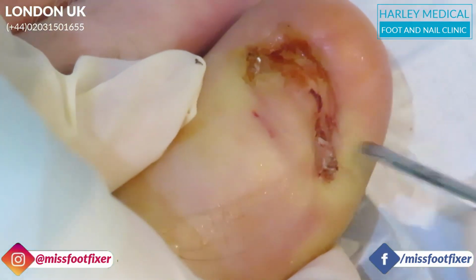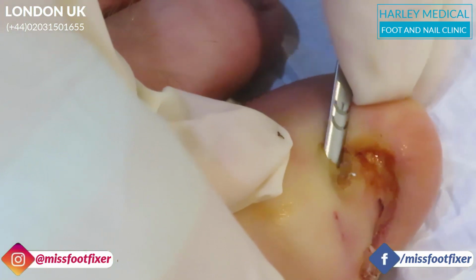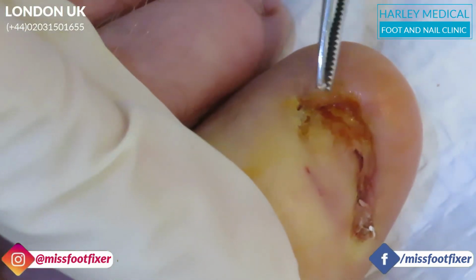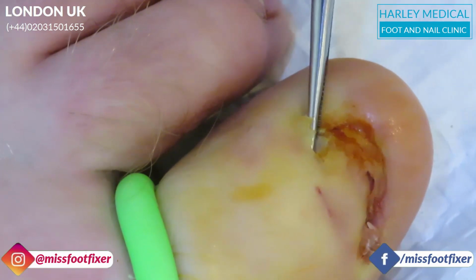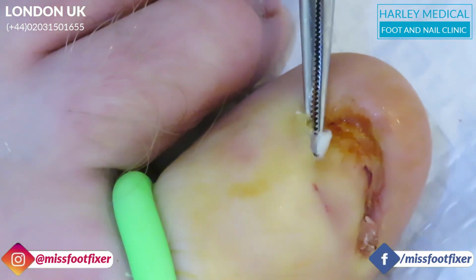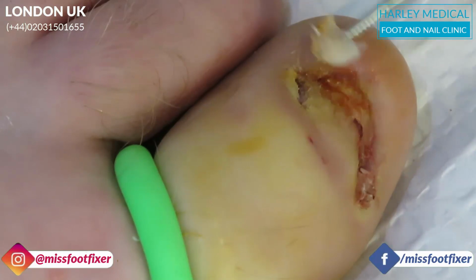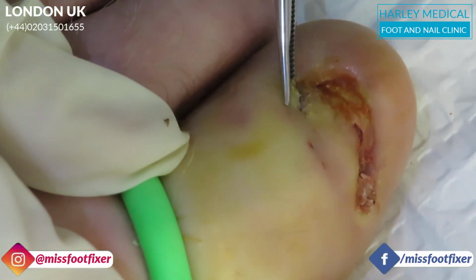Oh yeah, oh. The inflammation definitely isn't making it easy for you. No. So now it's done damage. Yeah, it looks really good. I'm just poking this bit out. Oh yeah. Taking a little bit out. Fantastic. So this, hey guys, so this, it was inside here. Didn't look that big, but it's massive. Little piece of nail. It's pretty amazing. Let me just clean inside.